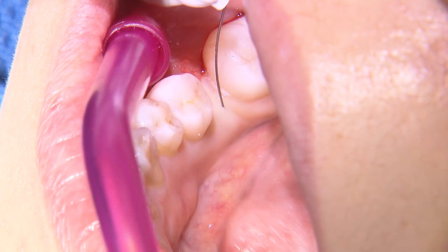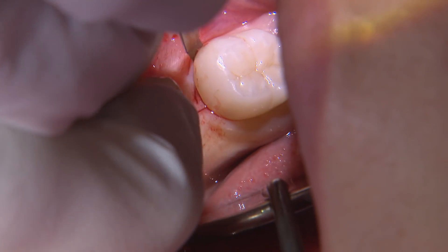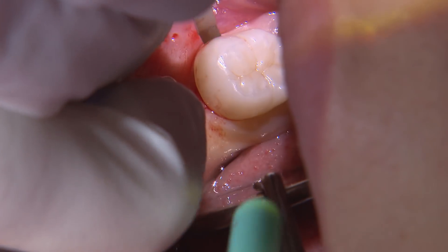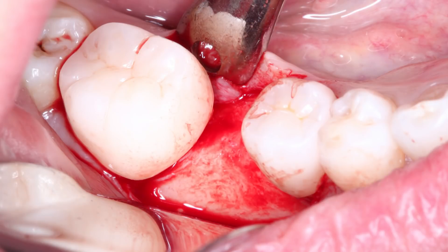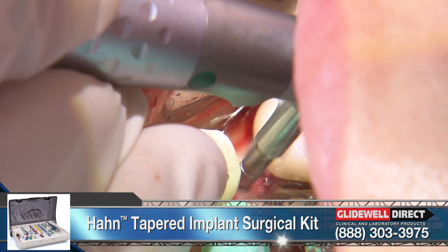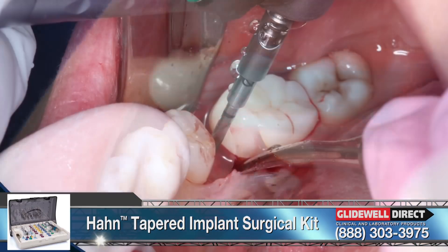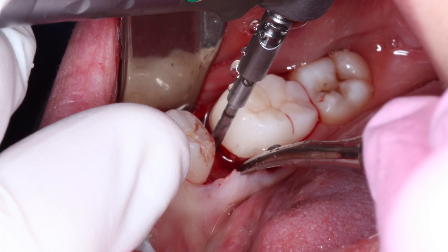Now on to the placement. After administration of local infiltrations, I create a mid-crestal full thickness flap so I can visualize the bone beneath. To reflect the soft tissue enough, I extend the incision to the mesial buccal and mid-lingual of number 29 and the distal buccal and mid-lingual of number 31. Once reflected, I begin the osteotomy with the first twist drill that's 1.5 millimeters in diameter, ensuring that I'm entering the bone parallel to the long axis of the adjacent teeth. The second twist drill in the sequence is 1.5 millimeters at the tip and increases in diameter to 2.4 millimeters near the coronal half to begin widening the osteotomy.